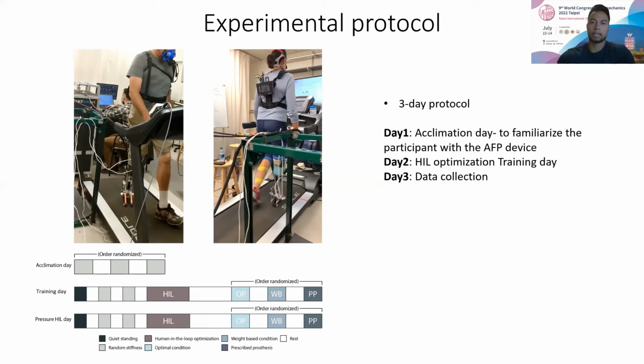Day 1 is the acclimation day, which is used to familiarize the participant with the device itself. We also use it as a day to fit the device to the socket, because each individual has a custom socket, and we need to cut a pylon and then fit the device. We have a prosthetist who comes in and helps with that.